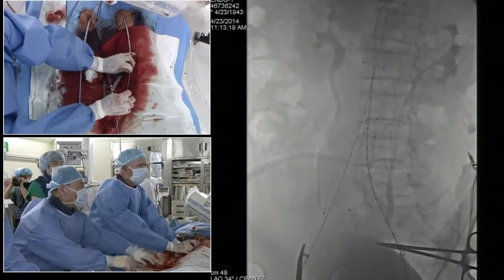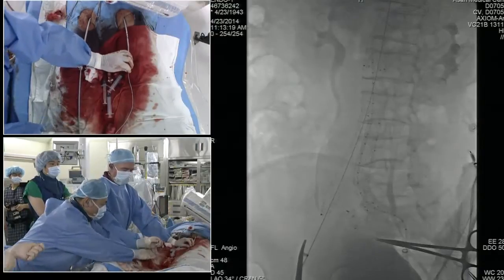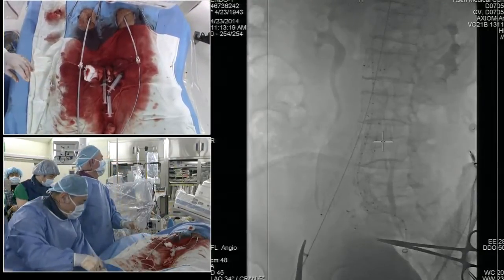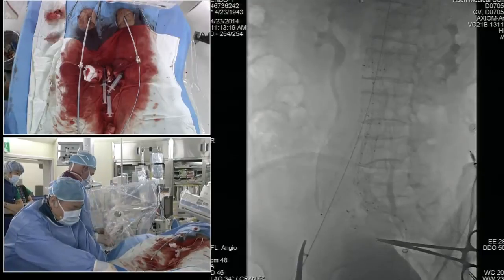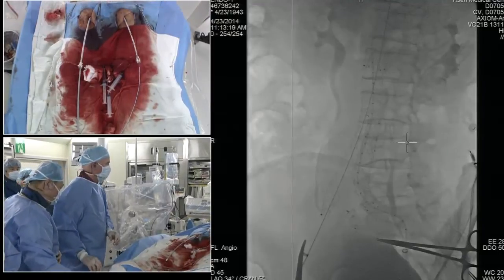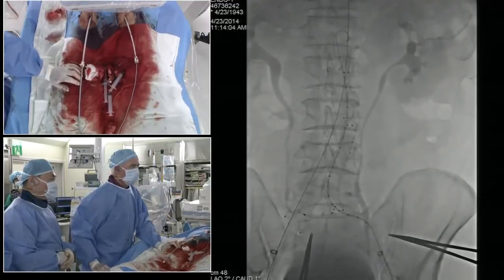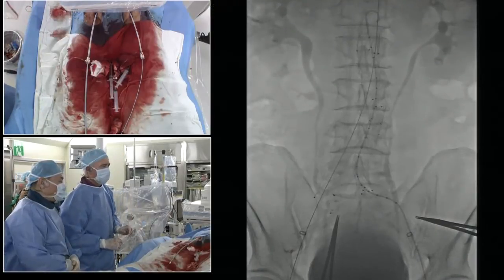Okay, wire up. So we'll go back to our AP shot here for this. I'm just trying to think if this is still a leak. I think you're right, let the heparin wear off. Couldn't you, John, theoretically just do a follow-up CT and see how it looks at that point? Yeah, I think that's possible, Michael, because it's a pretty small leak. And it may well seal off once his anticoagulation is off.